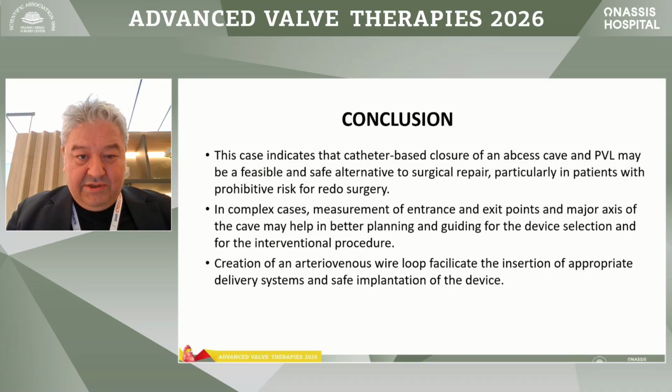But in complex cases, measurement of entrance and exit points and the major axis of the cave may help in better planning and guiding for the device selection and for the interventional procedure. And the creation of an arteriovenous loop facilitates the insertion of appropriate delivery systems and safe implantation of the device. Thank you very much for your attention.